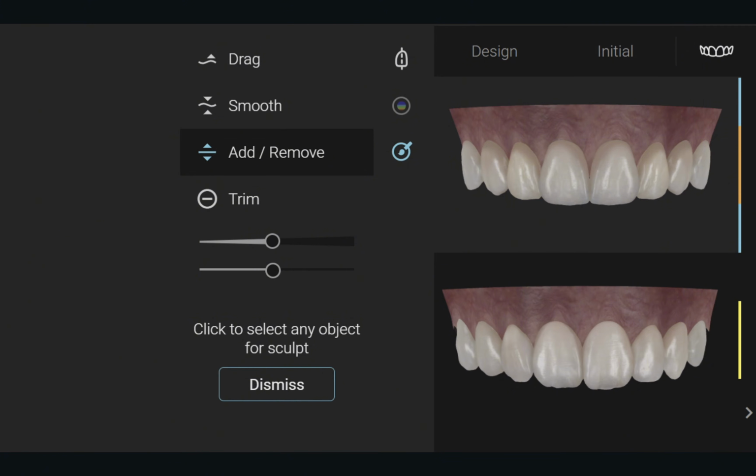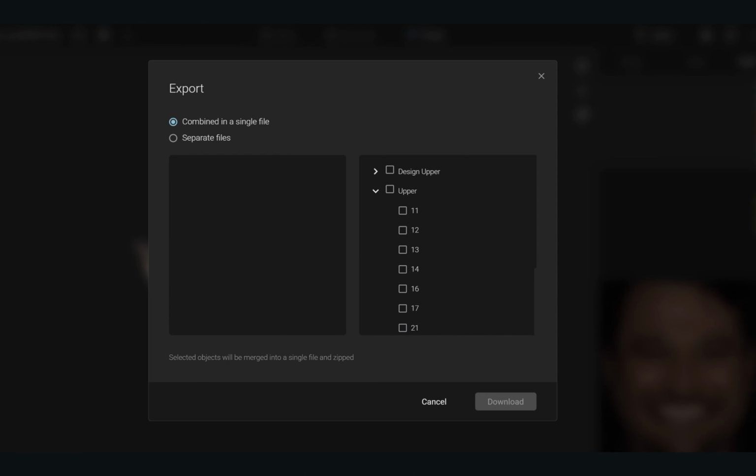But as I said, the founders of this software really emphasize, don't go messing with files, because let's use the analogy of if you have a round hole and you're trying to fit a square peg through that hole, the square peg is not the right choice. And it's the same with teeth. If it's not compatible, change the file, choose something different. It will make your life much, much easier.